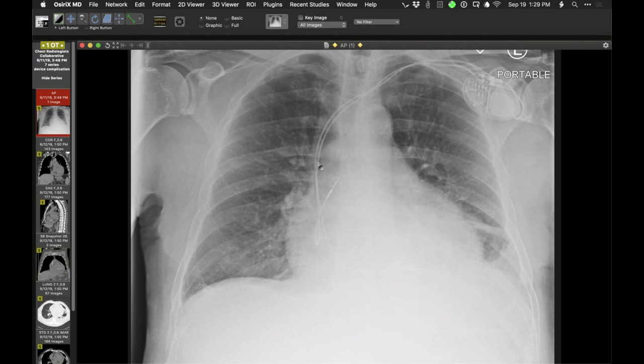And then typically with the atrial appendage lead, it comes down and typically kind of sweeps towards you, with the tip being about here somewhere, but this tip is too high. That sweep is a bit unusual, because usually the tip doesn't project that high, but rather comes down and sweeps here, kind of. So this is interesting.